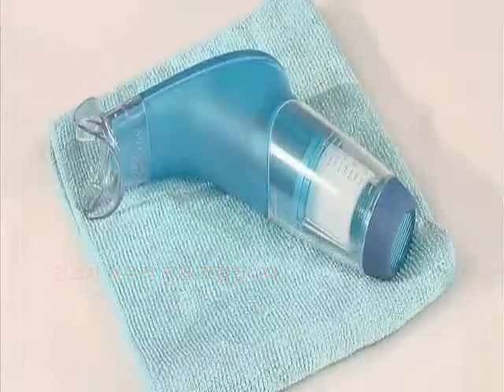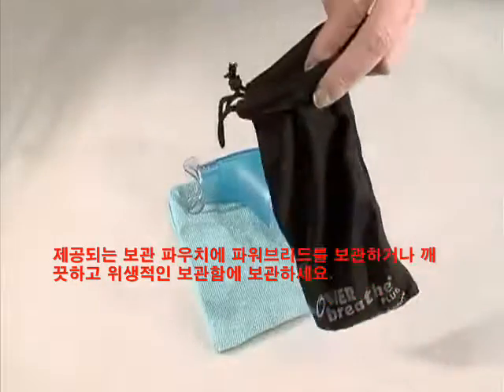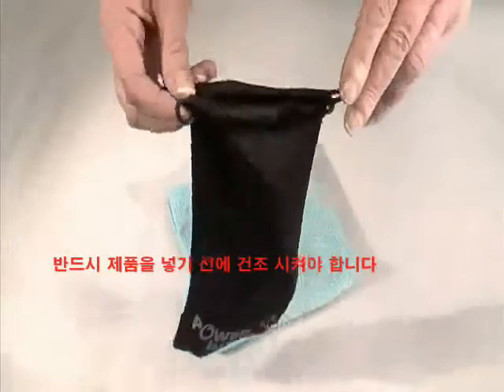Assemble it when it's dry. Store your PowerBreathe in the storage pouch provided or in a suitable, clean, hygienic container. Make sure it's dry before putting it away.